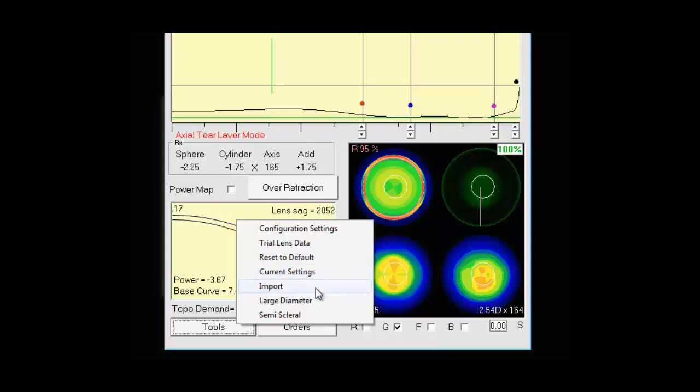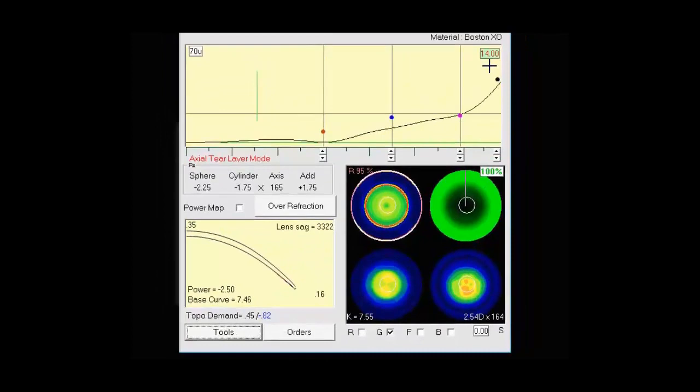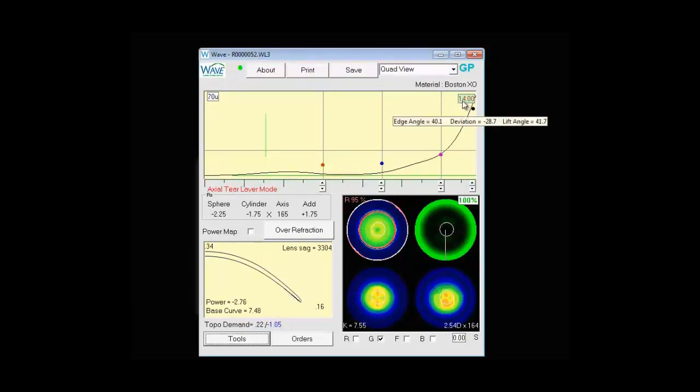Import will allow you to import a design. And then we have large diameter and semi-scleral lenses. Large diameter is going to default to a corneal scleral type design. So if I select that now you'll see it will change the diameter to 14-0. It will align centrally and give a little more edge lift to get over the limbus. You'll notice as we get to a large diameter lens we have a little red indicator here. And if we hover over the diameter we have edge angles, deviation, and lift angle.